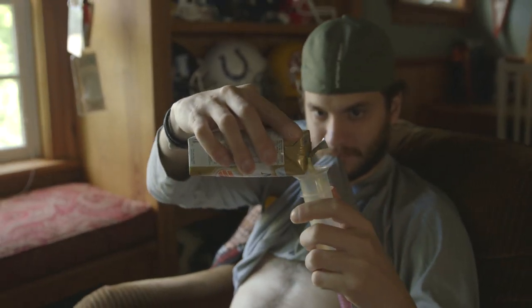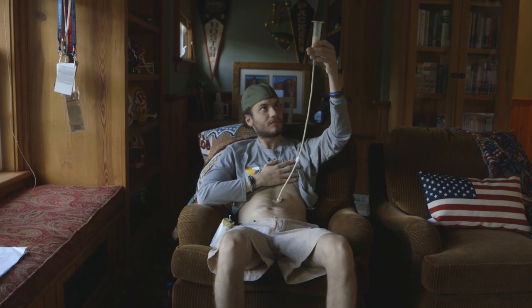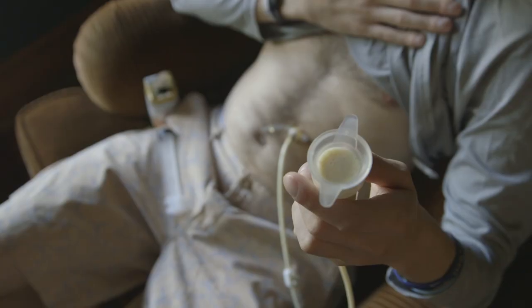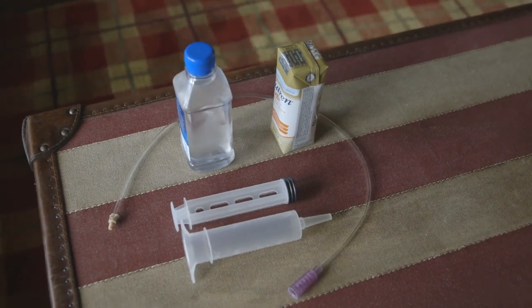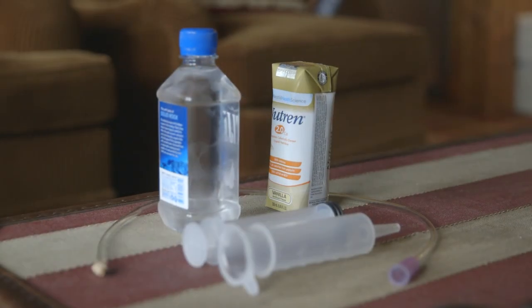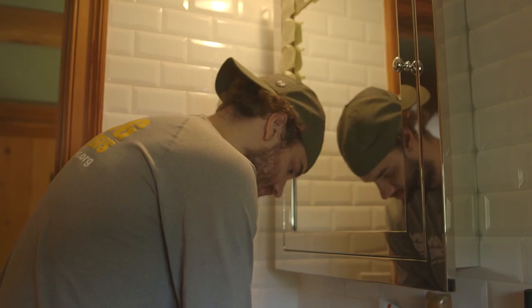First, we will cover bolus feed. Bolus feeding is a quick, easy way to get calories during any time of the day without the need for a pump. Before starting, you will need the following supplies: formula, a syringe, extension set, and water. Keep in mind that everything should be at room temperature.